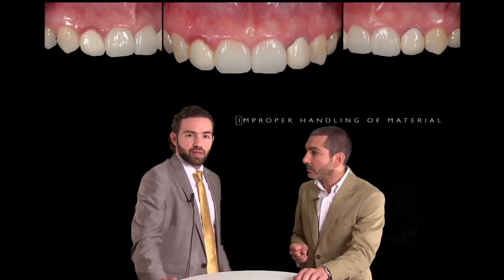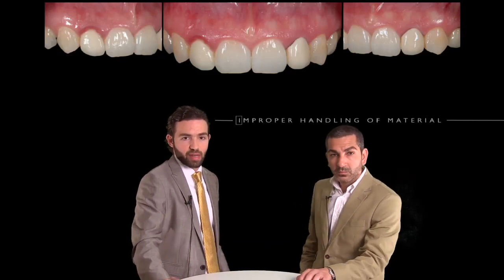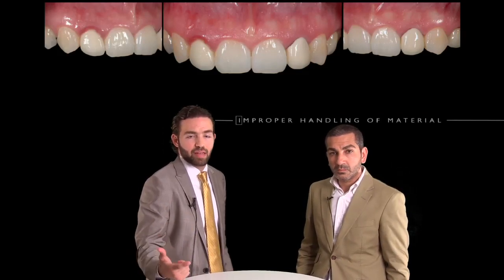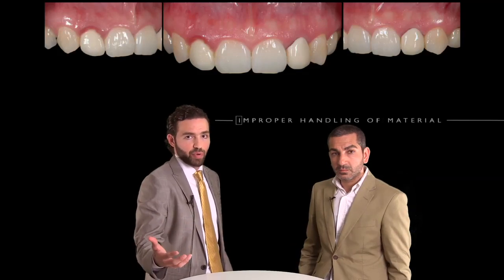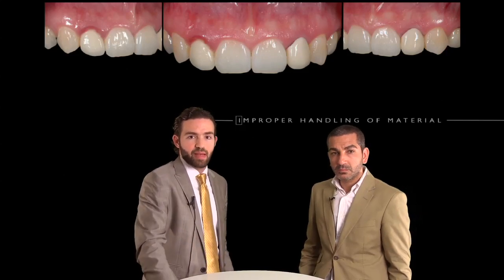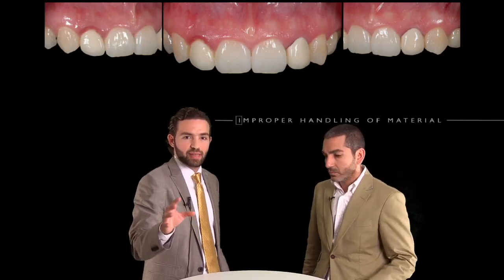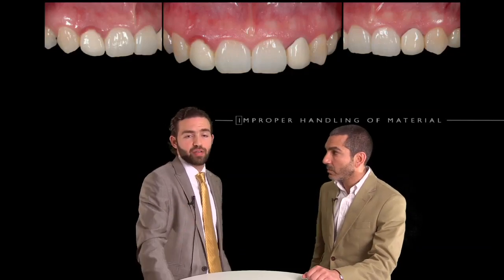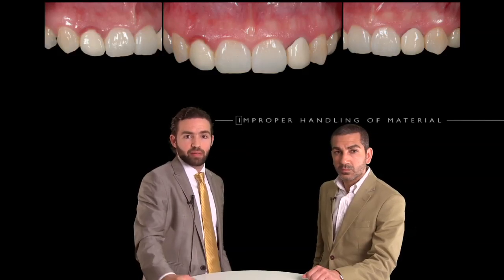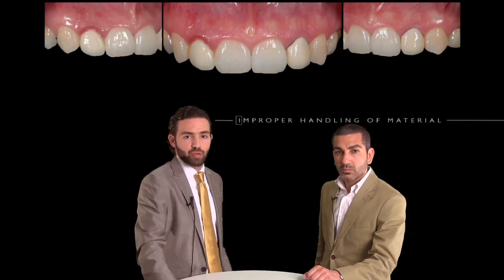Now, we said earlier that the two main reasons for success of our restorations and our outcomes are the knowledge, which is the material selection, and also the proper handling of the material, which is the skills of the operator and the technician. In this instance, what you see on the screen is a patient that actually walked in, and it was quite interesting to see the two lateral incisors, where it demonstrates the improper handling of porcelain fused to metal. You see the right lateral incisor, how the tissues are really not reacting very well. There's probably a violation of biologic width.